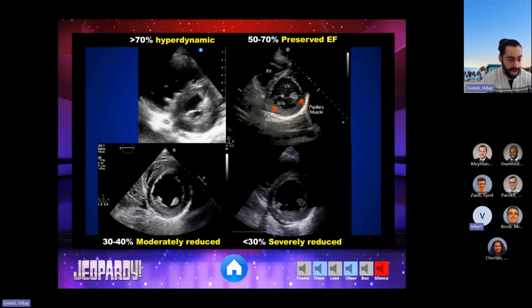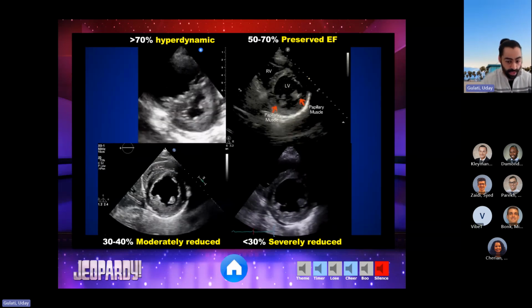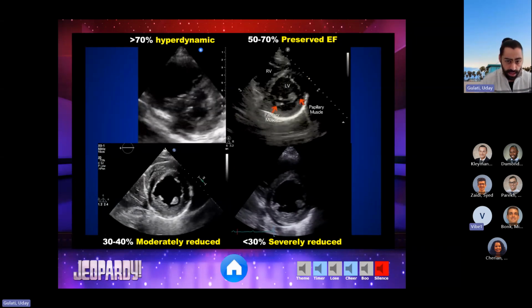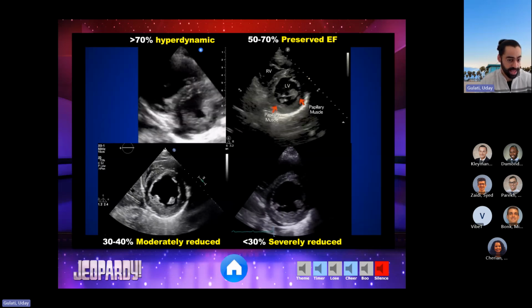What really matters is the cardiac output. A patient's propensity to have decreased cardiac output is significantly higher with something that's severely reduced. Someone who's severely reduced can still have an okay cardiac output if their heart rate's fast enough, right? So this is a global assessment, and the only way to get better at this is to keep assessing it, or use things like M mode, right?